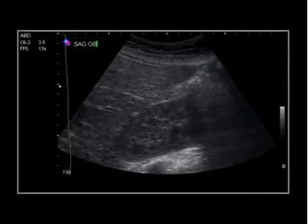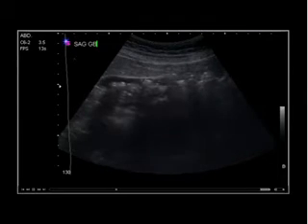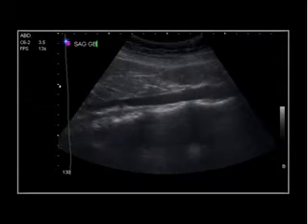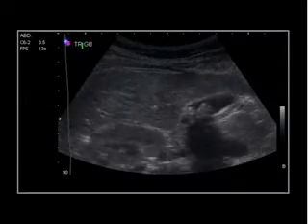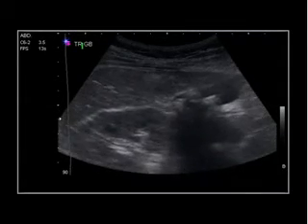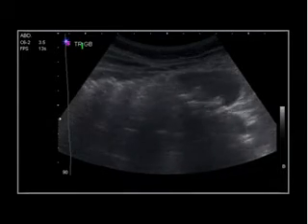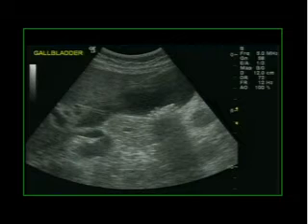And then watching this video, we can see the patient's kidney, and now we see a number of stones that fill up the patient's gallbladder. We can also look at the same structure in transverse, and we can see the stones with their acoustic shadowing. Unfortunately, it's not always that easy. In this case, you can easily misidentify these echogenic stones as part of the gallbladder wall. We can see some shadowing that derives from those stones.